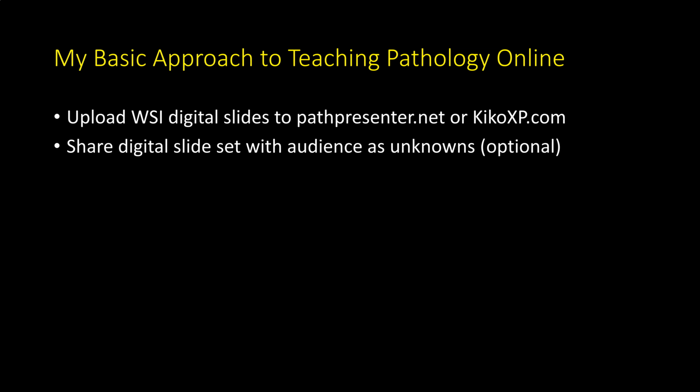A lot of times I'm going to be giving an invited talk to some residents at another institution via Zoom or Teams or something like that. But you could also use it as an individual case, or you can use a digital slide set for your own residents in your own institution, however you want. So then I'll share the digital slide set with my audience as unknowns usually, although that's optional.